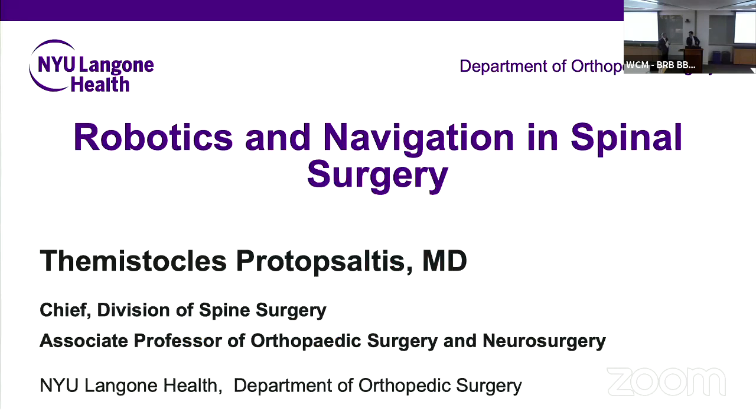fluoros in the lateral, because I think when you're in the lateral, the farther away you get from that reference, as opposed to being in a Jackson or something where you're really locked in, the more that upper torso kind of moves independently. So if you're doing single position surgery, you've done some nice interbodies, and you come up, do some lateral, and then you're going to come from behind and put in all of your pedicle screws. That's fine to start down at the bottom. You're not going to have too many problems at L5, L4, S1. That's not really too much of a problem. But when you're up and around L2, L3, you've got to be really careful pushing on the patient and moving.